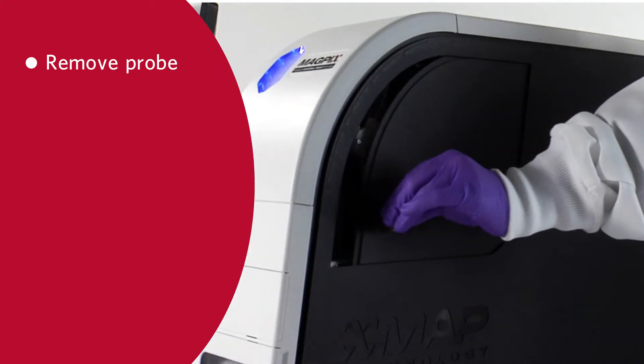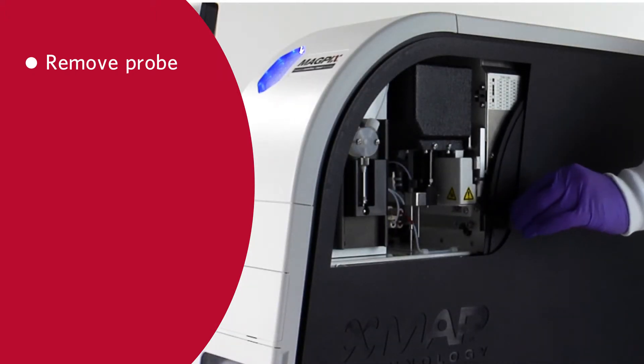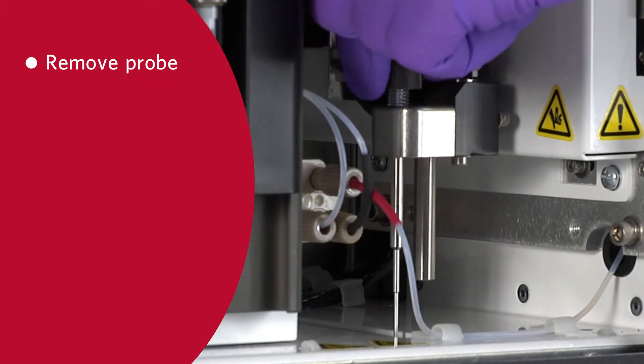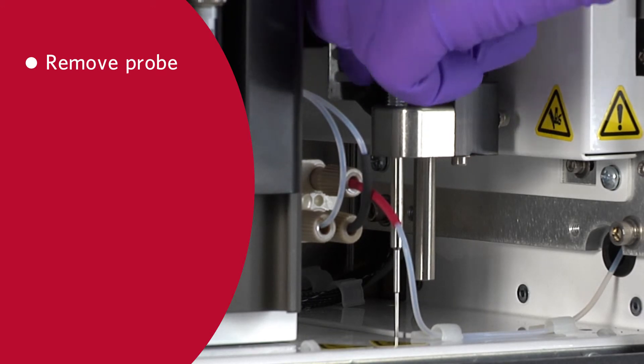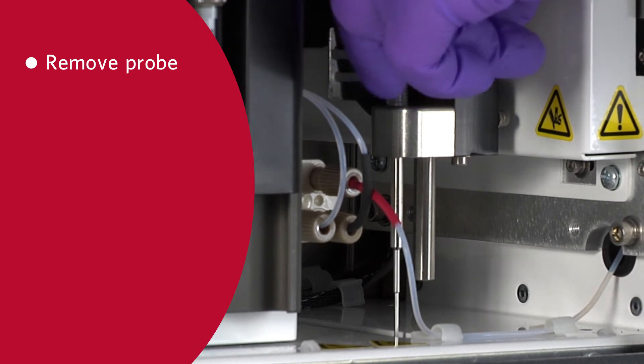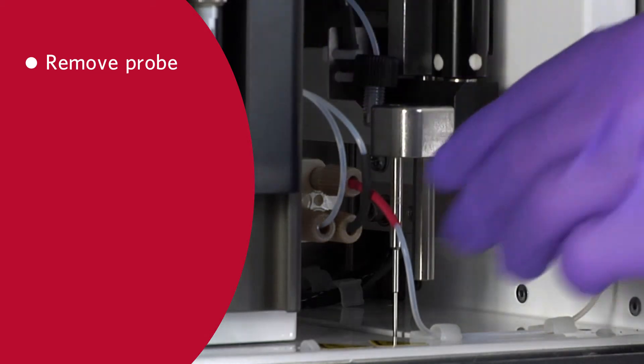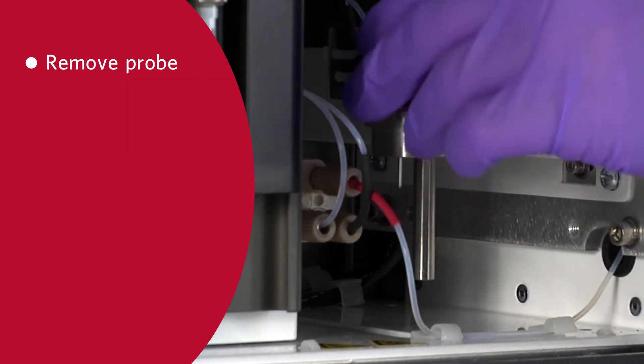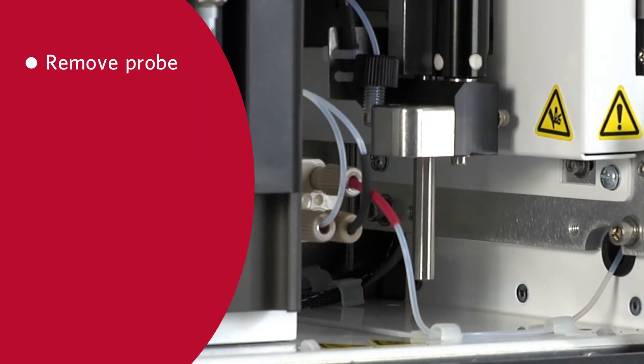To remove the probe, first open the side access door of the MAGPIX. Completely unscrew the sample probe fitting on top of the sample probe holder. Grasp the sample probe gently and push up. Lift the sample probe out of the instrument.